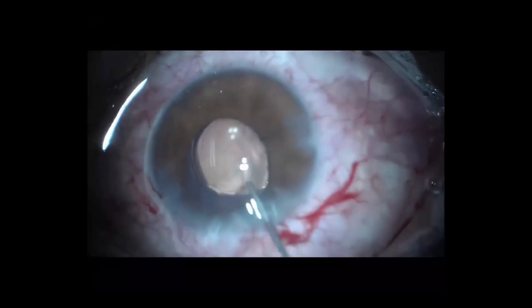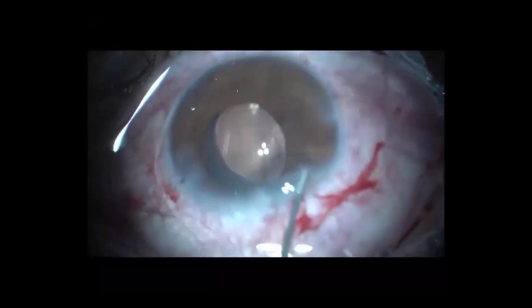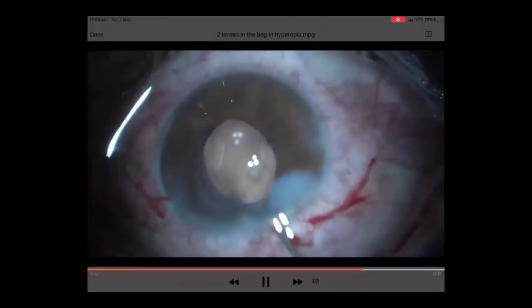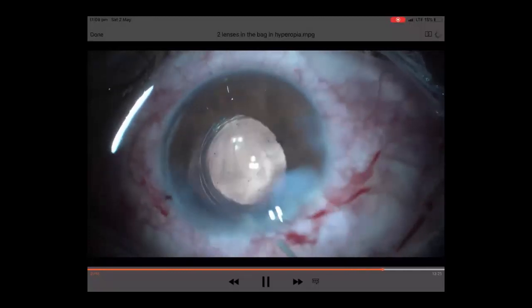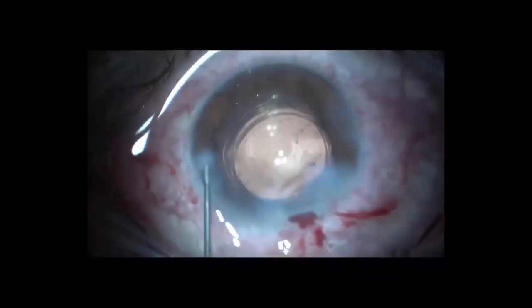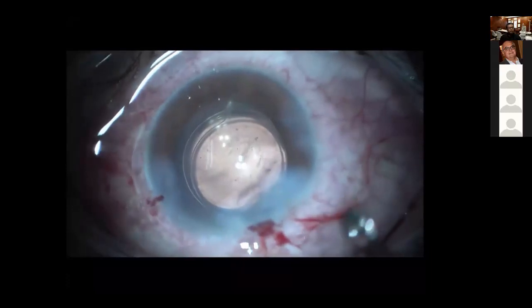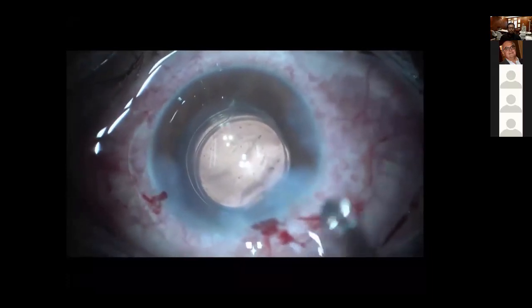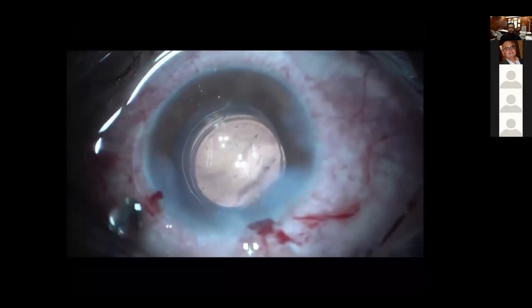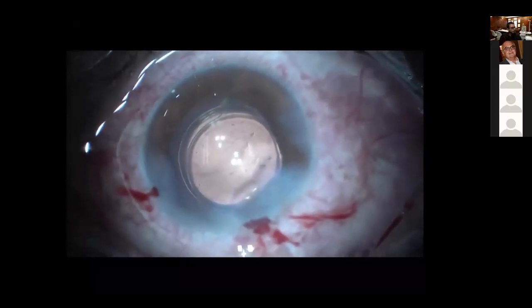I prefer to put the highest power, and then maybe the idea of an ICL over the lens is more appealing for me. This is a good choice too. Definitely, I can go for this. It's quite convenient, but it would require another procedure and more costs for the patient. So of course, yes, you have to think about it, and then you consult with your patient and see what's better for him, and then you can both decide. Even though the patient usually tells you, you are the doctor, you should decide.